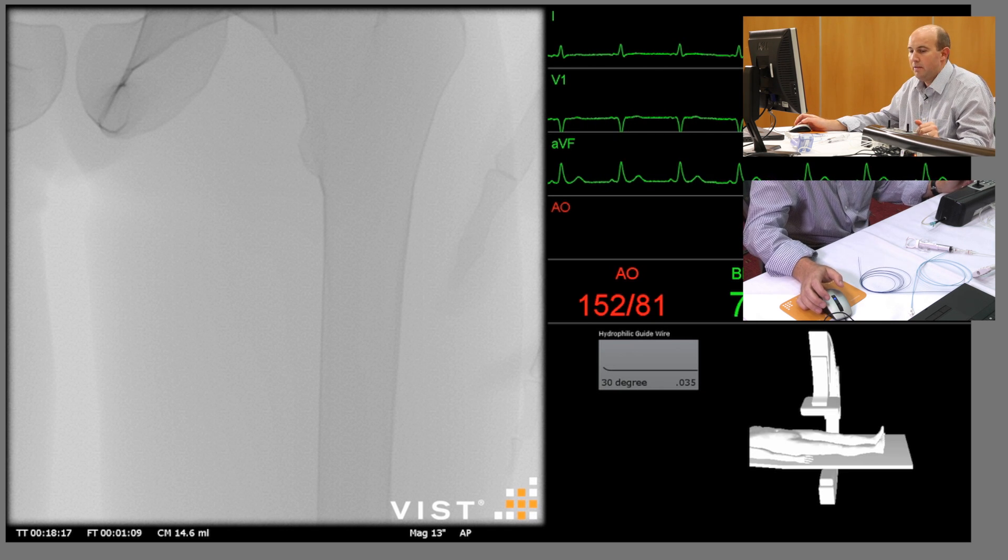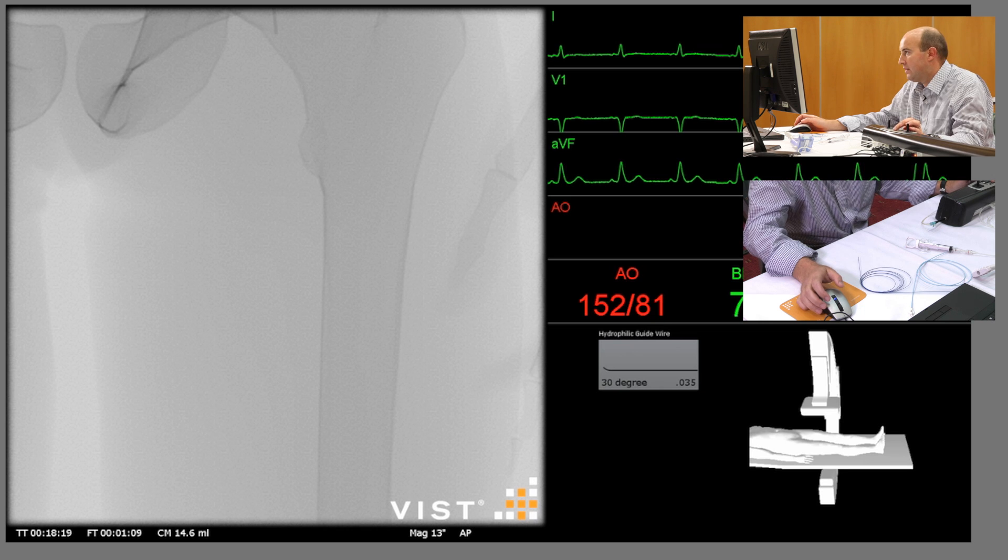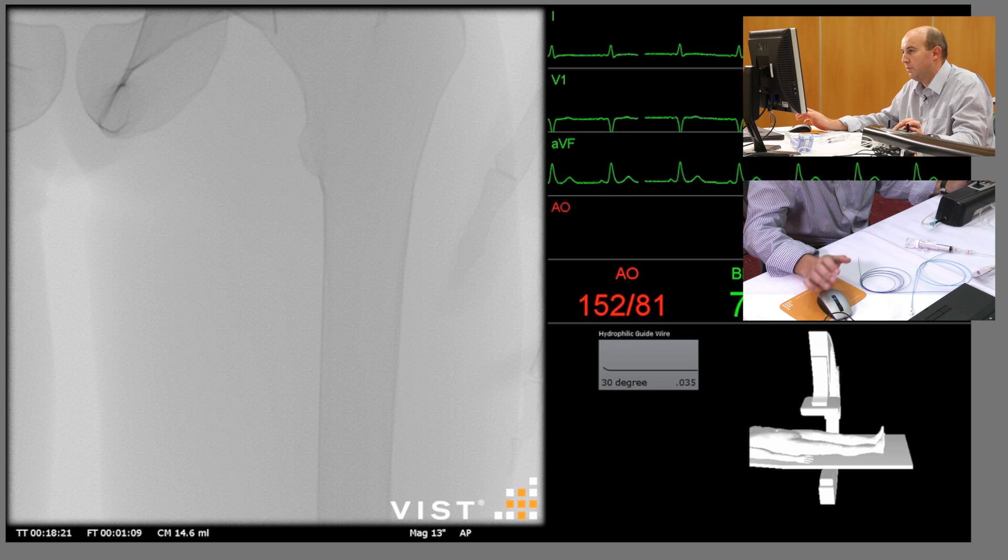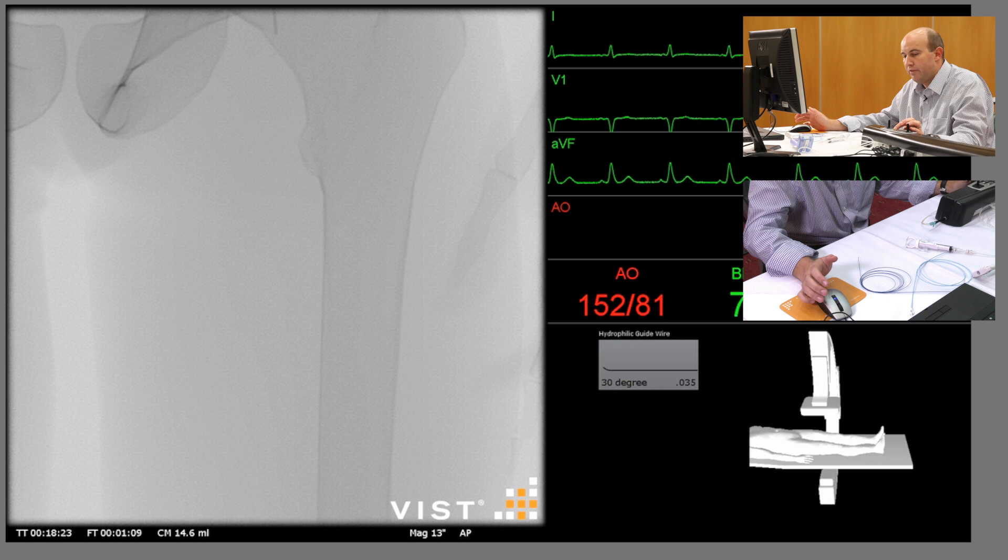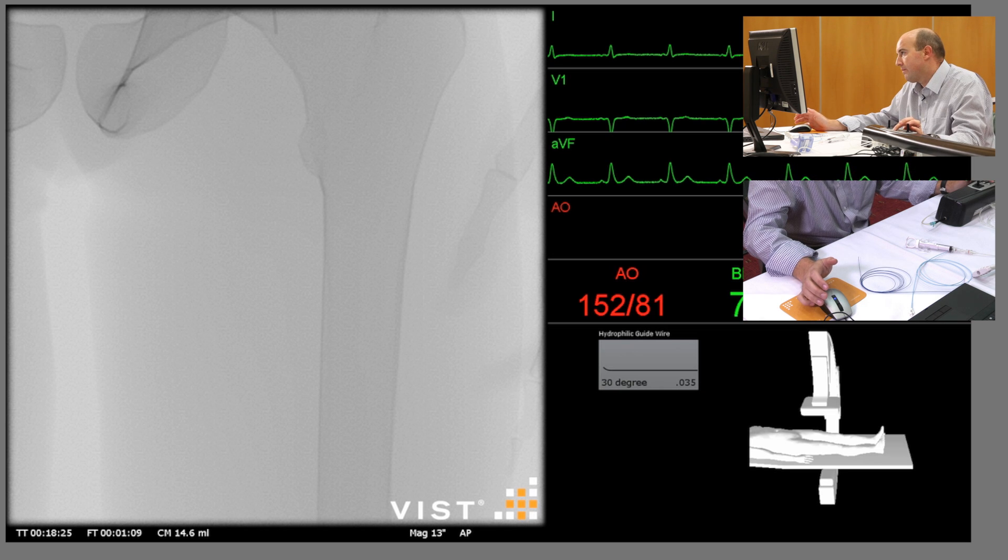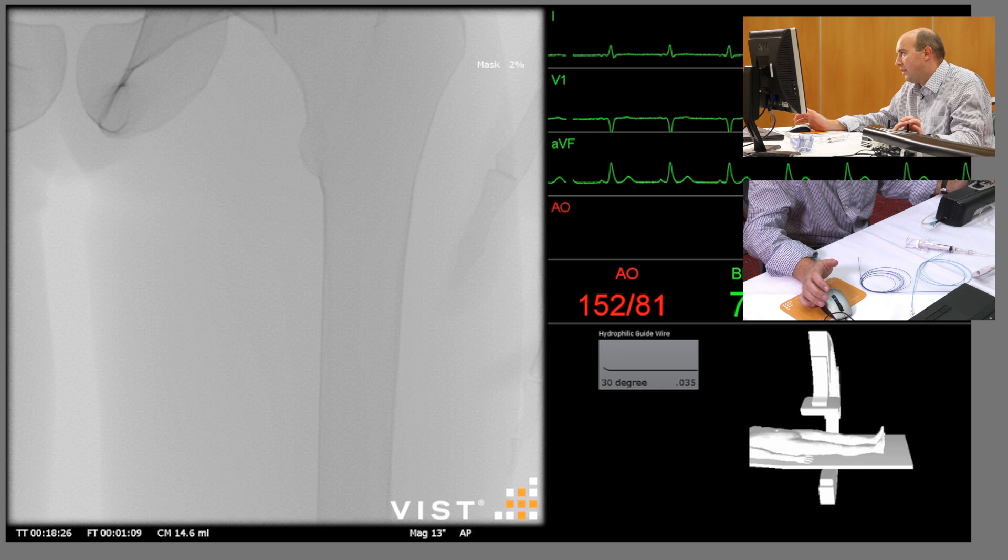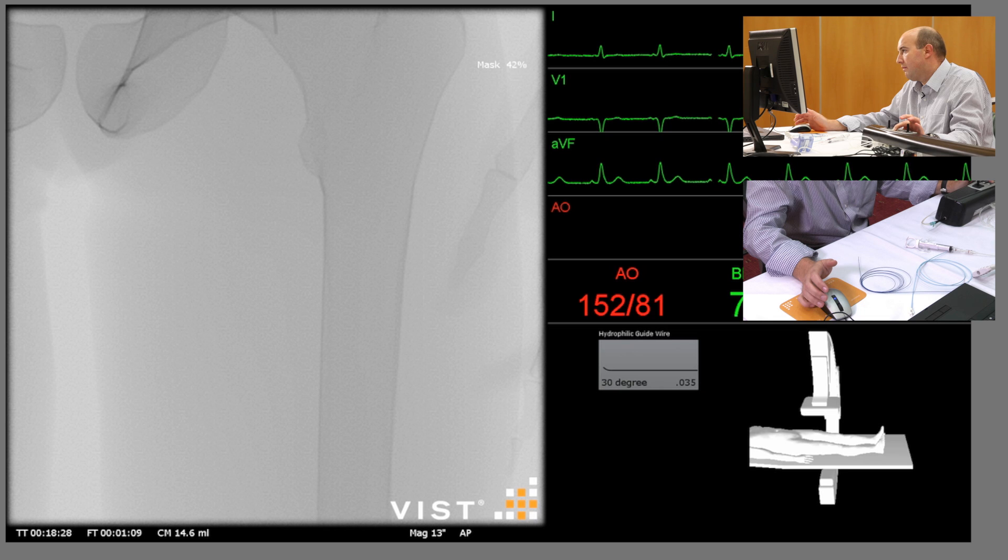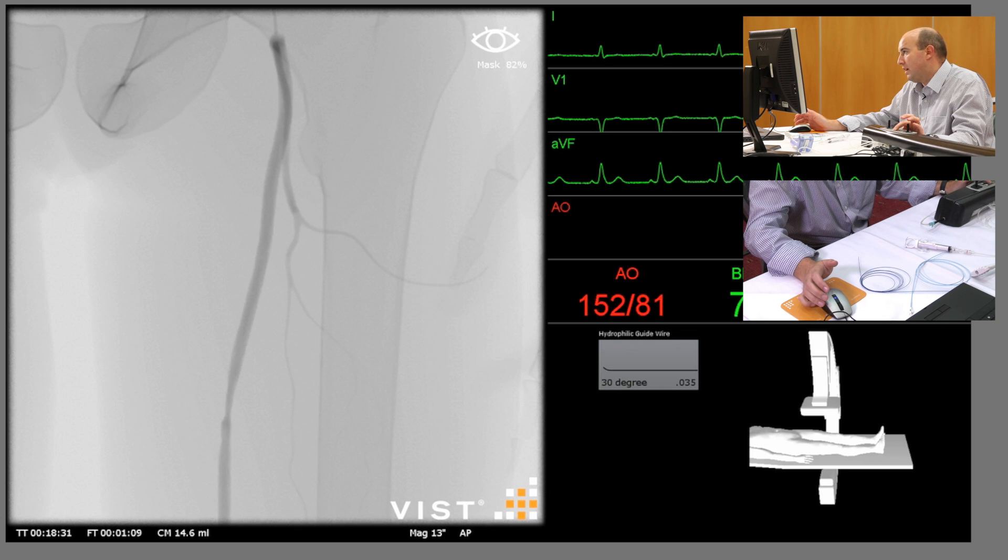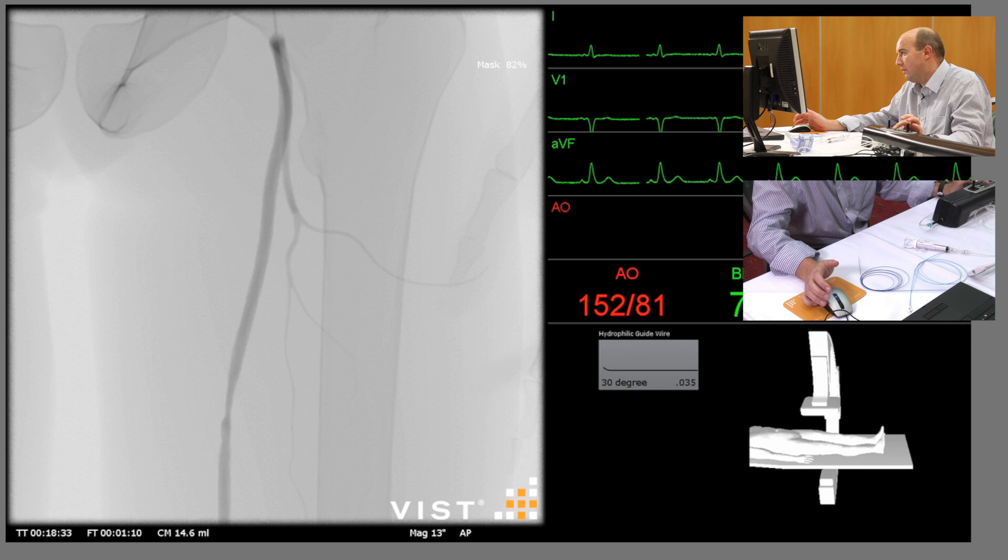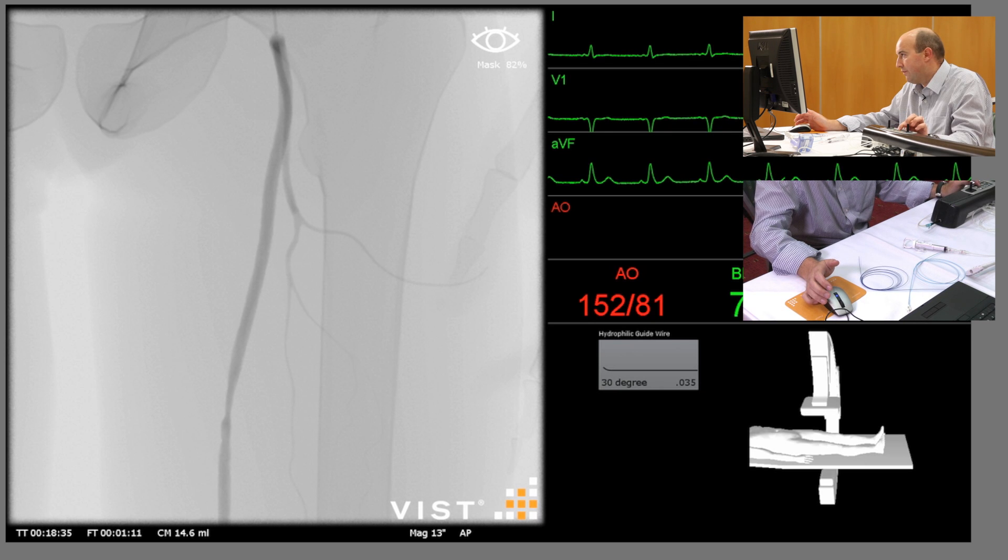You can see the tip of the sheath again, but we can fade in the mask because we're not going to move the C arm because we can actually see the lesion of interest in that image. The mask can be brought in, and once I press the pedal there, you can see the lesion.